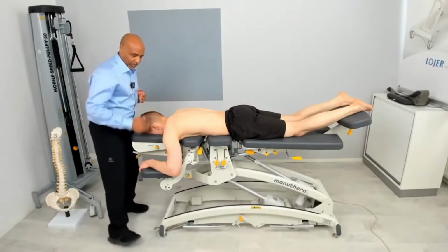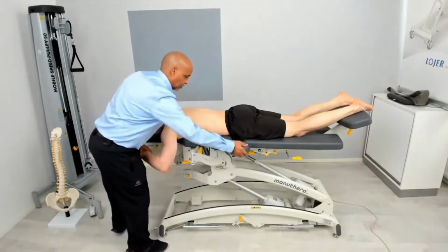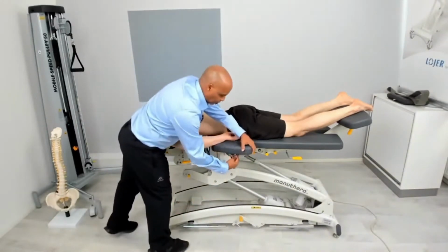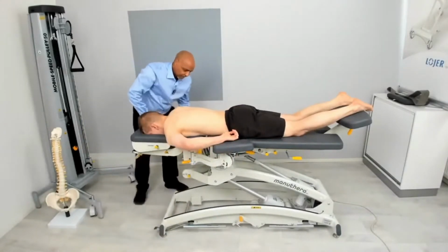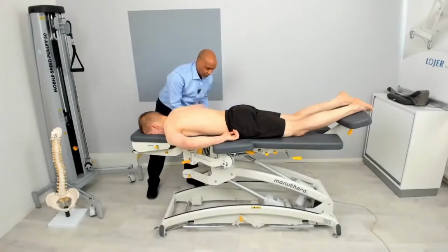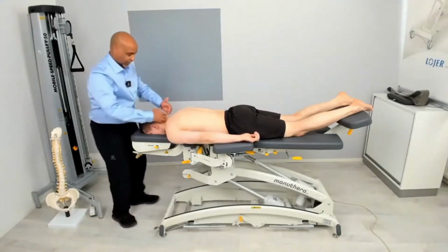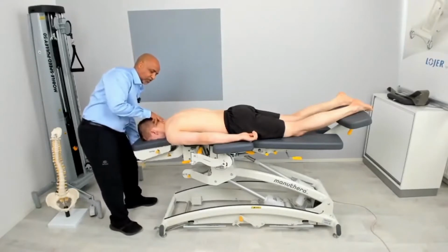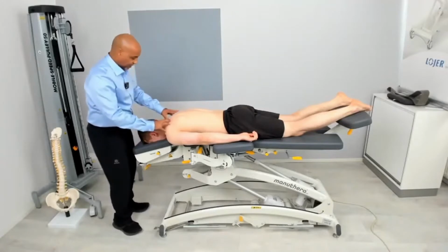How do I approach it? The first thing is I'm going to lift this particular part of the armrest and get the patient into a very comfortable position. From there, I have exposed the neck to be more free. Then there is a little bit of movement which I need to change to put the neck in no extension. There is no extension, so this is much more comfortable now in this particular case.